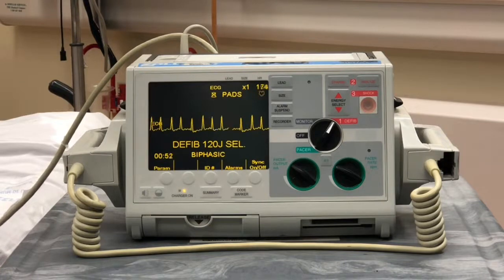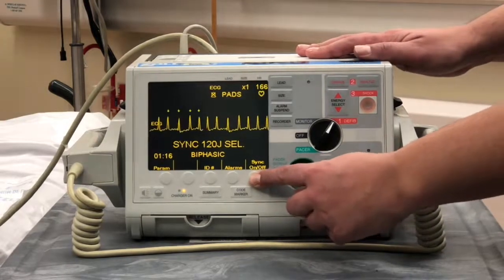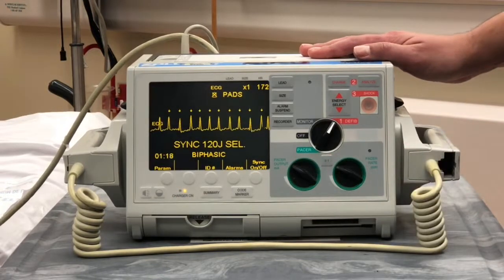We notice that our Zoll M series is turned to defibrillation, and our energy is set on the screen to 120 joules. It's very important, although our patient is unstable, they still have a pulse, and we want to make sure that we are using a synchronized shock, and we're going to go ahead and press the button on the bottom screen in order to ensure that our cardioversion is successful.